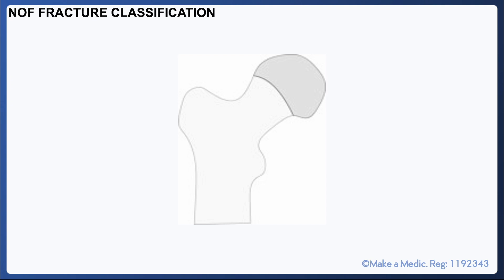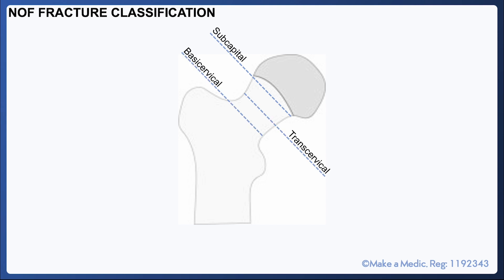Neck of femur fractures are described based on the location of the fracture. A subcapital fracture occurs at the junction between the head and neck of the femur. A transcervical fracture occurs through the neck of the femur. Basicervical fractures occur at the base of the neck of the femur, and intertrochanteric fractures occur between the trochanters. A fracture that occurs below the level of the trochanter is described as being subtrochanteric.